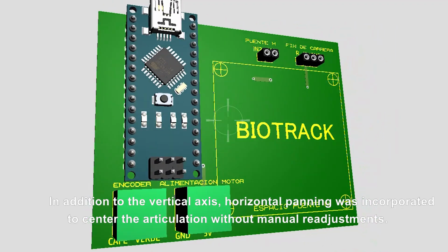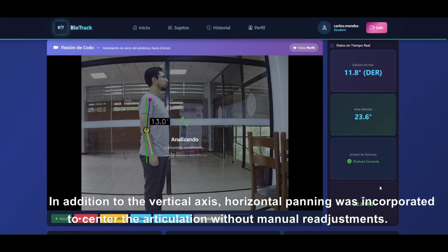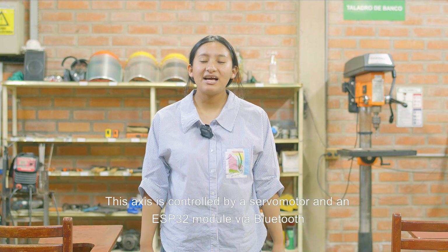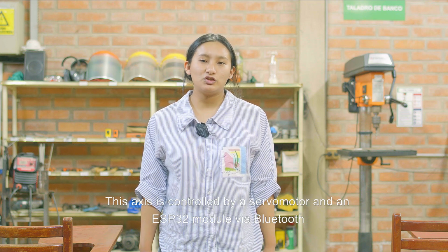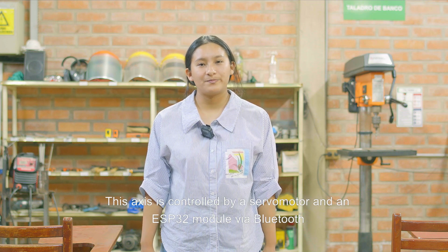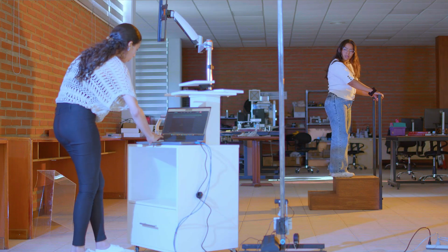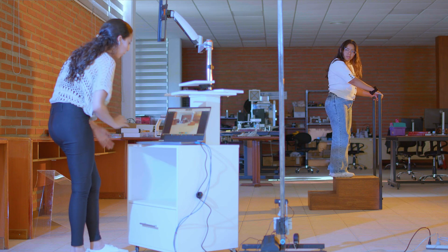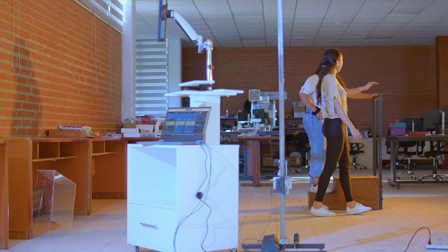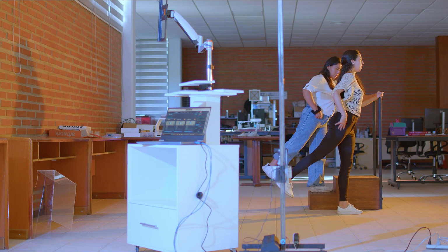In addition to the vertical axis, horizontal panning was incorporated to center the articulation without manual readjustment. This axis is controlled by a servo motor and an ESP32 module via Bluetooth. From a circuit and systems perspective, the project's main contribution is integration: closed-loop control to standardize capture, video signal processing to estimate angles, and an interface that turns all of this into a guided and recordable practice.